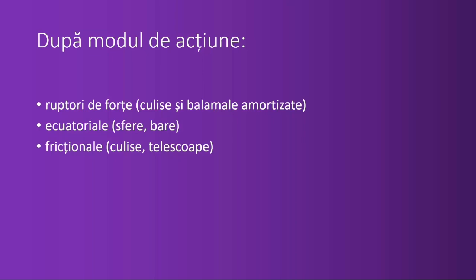Then we have equatorial systems, spheres or bars. What does that mean? That means they do click. They make the sound of a click.